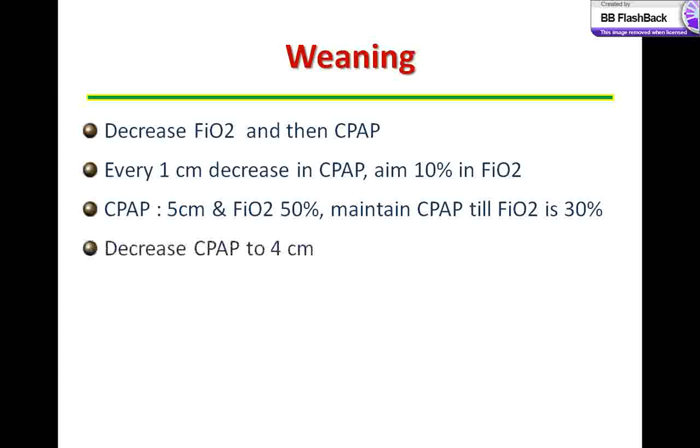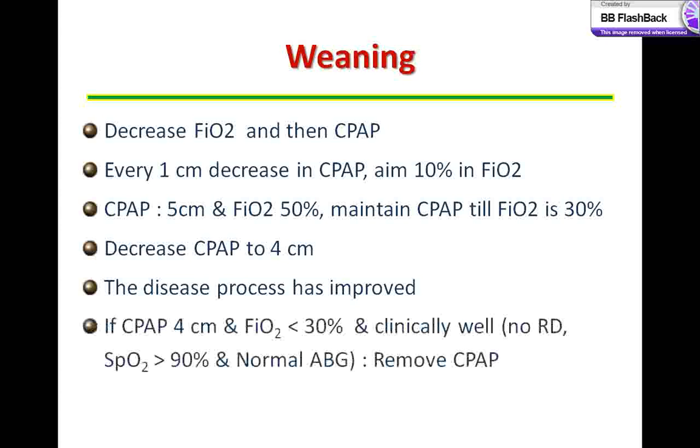All this while, keep judging the adequacy of lung inflation, oxygenation as judged from the saturations, and also look for comfortability of the baby. Now, one would remove the infant from CPAP when the disease for which you started CPAP is under control, like respiratory distress syndrome. We have controlled the respiratory distress, and if it is apnea, the apnea is under control for 24-48 hours before you remove the baby from CPAP. CPAP is removed when the pressure requirement is 4 or less than 4 centimeters and FiO2 requirement is less than 30%.